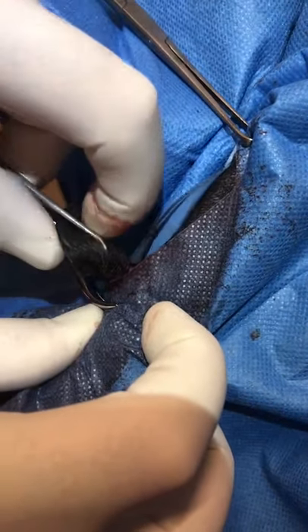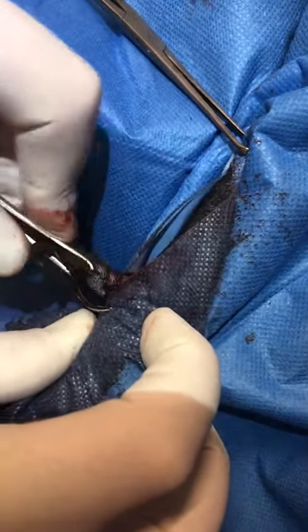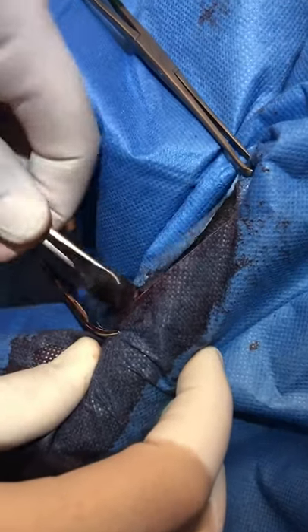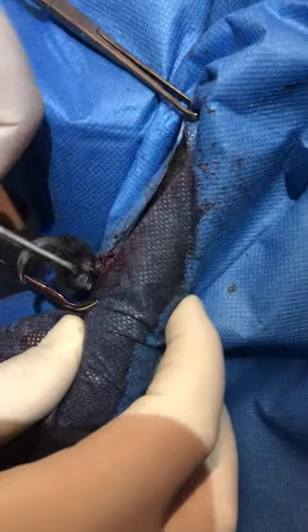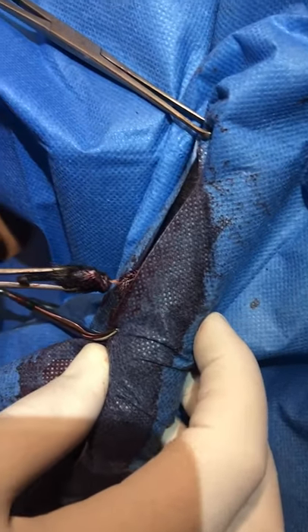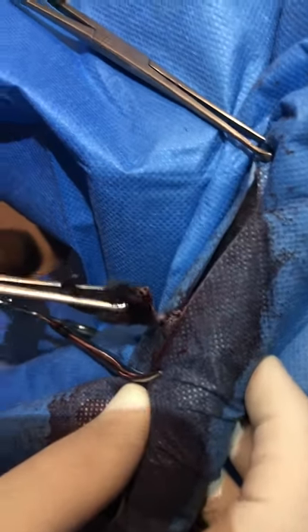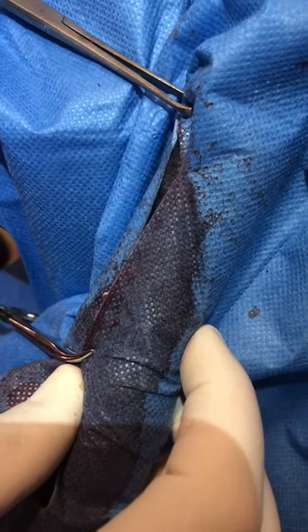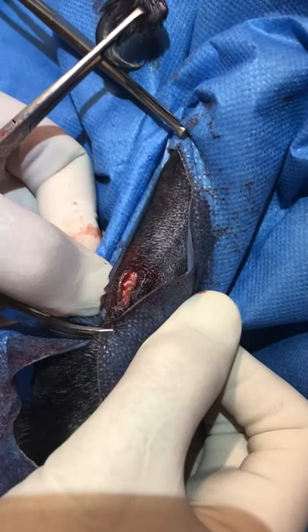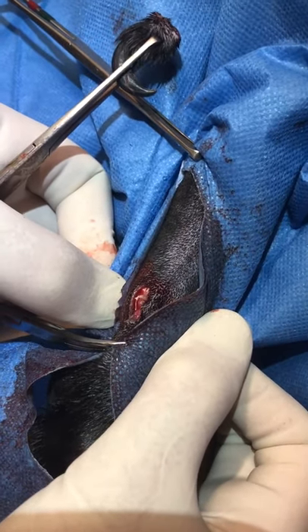That twisting will tie off the blood vessel inside and leave us with just a little skin incision to close. It becomes easy when it's a little twisted pedicle left inside — if you just keep twisting, it comes off and there's no bleeding at all. We just have the skin incision to close.